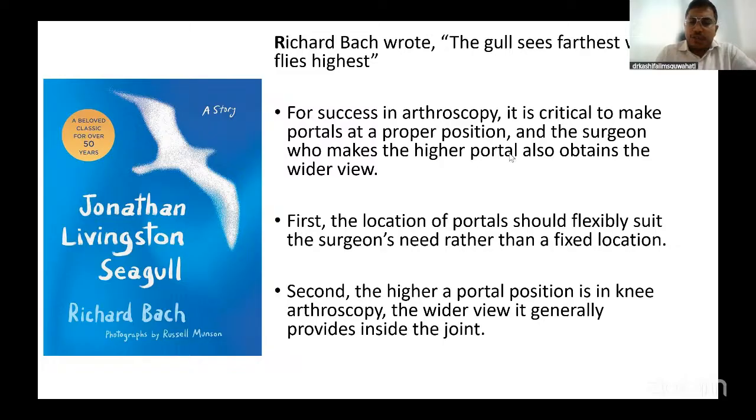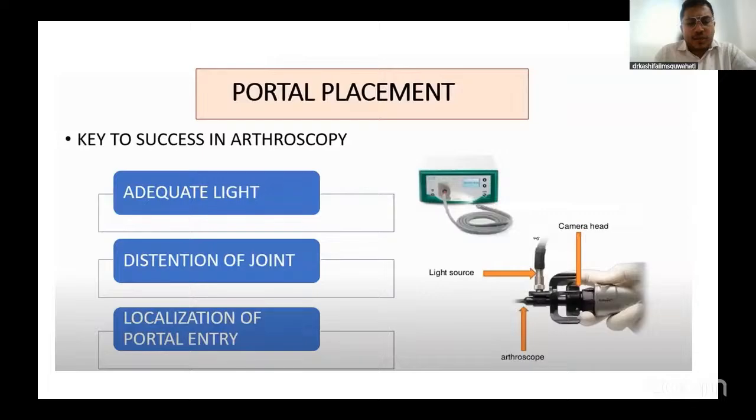First, the location of portals should be flexible. It should suit the surgeon's need rather than a fixed location. And the second point is that the higher the portal in the knee arthroscopy, the wider the view inside the joint. So the key to success in arthroscopy, as Dr. Parag sir was saying, is that you need a very good portal. Apart from that, you need a good light source and the distension of the joint.